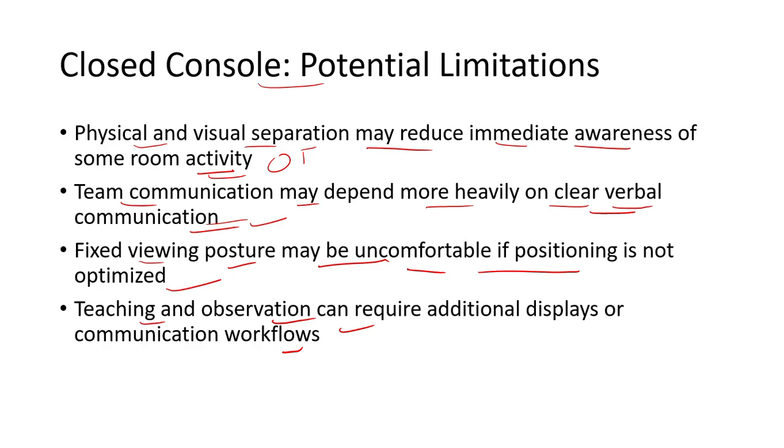Because of that, no one other than the surgeon can see through that 3D viewer. So teaching and observation require additional setup: they have to attach another external monitor to the console, or they have to buy a dual console. That will help in the teaching and observation of the case. So that is the limitation of the closed console.